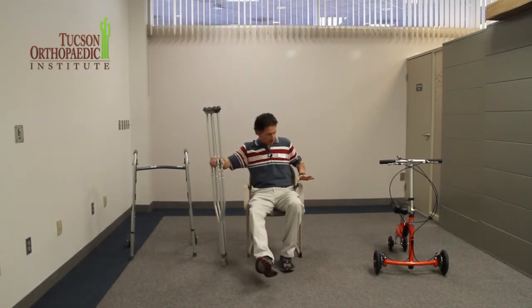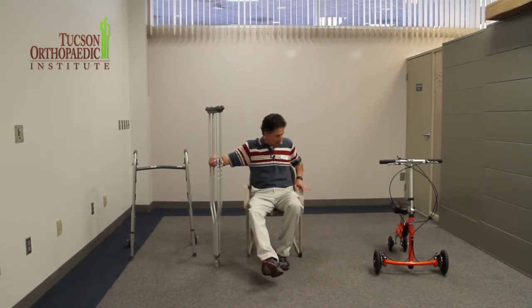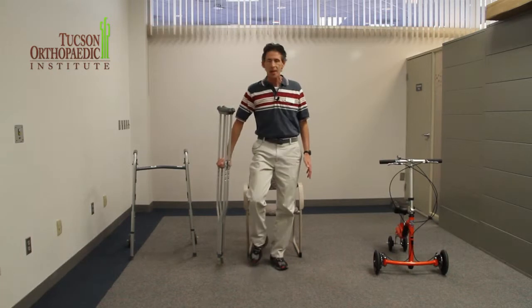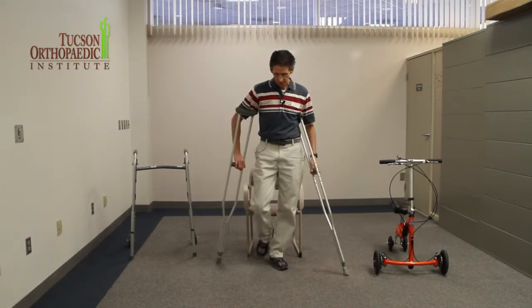So for me to get up from here, what I'm going to do is use my arms and hands on the crutches, and my left hand on the left arm of the chair, and I'm going to stand up. Then I balance myself and I can put one crutch over to my left side and one on the right.